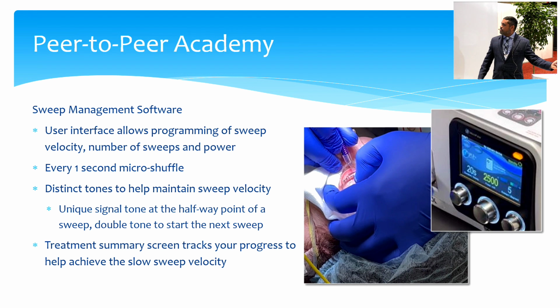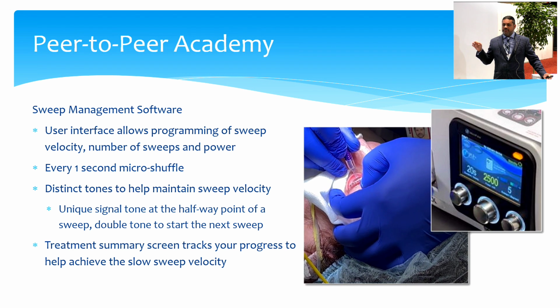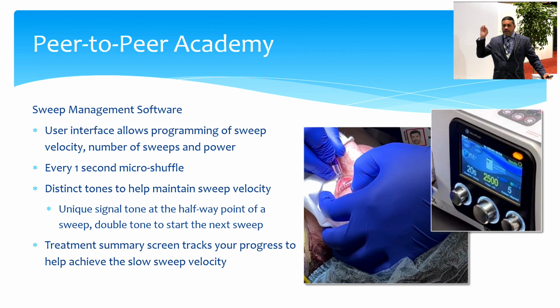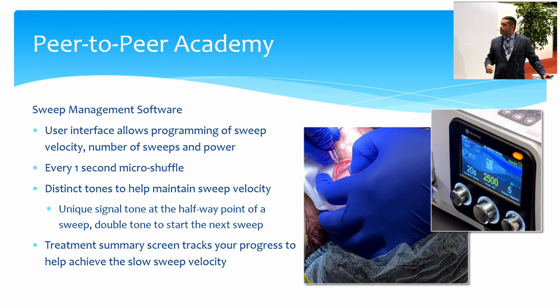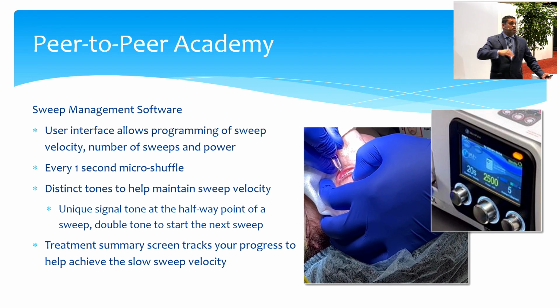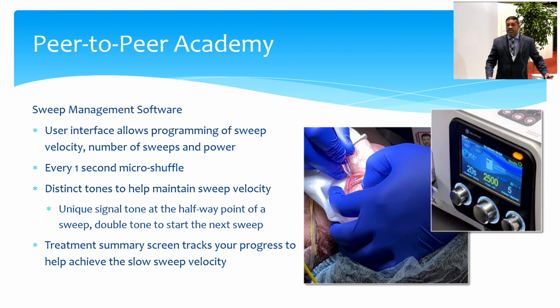So let's see if I can get the video. Okay, so you can hear the beeps. Boom. That's halfway through. Boom, boom. That means you're at the end of that sweep. You need to turn around and go back the other direction.